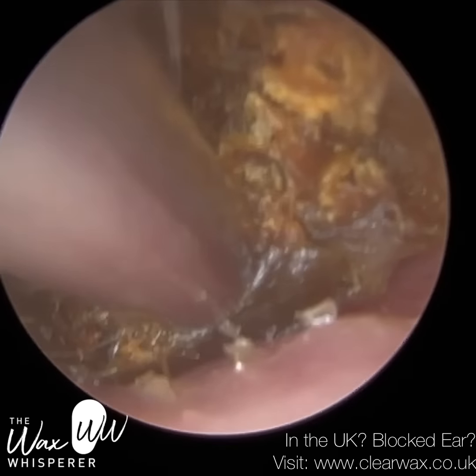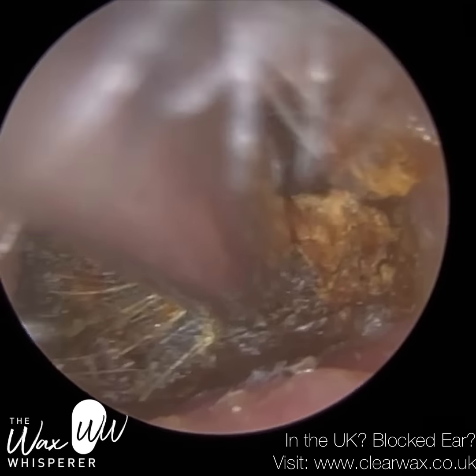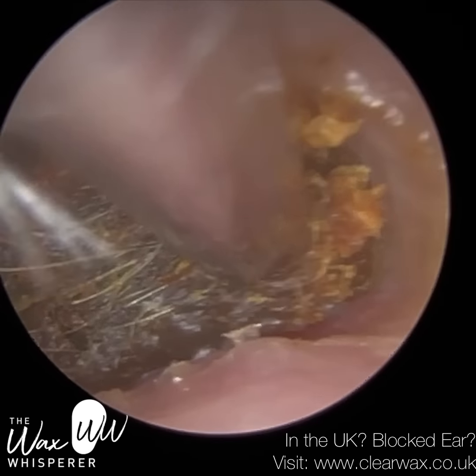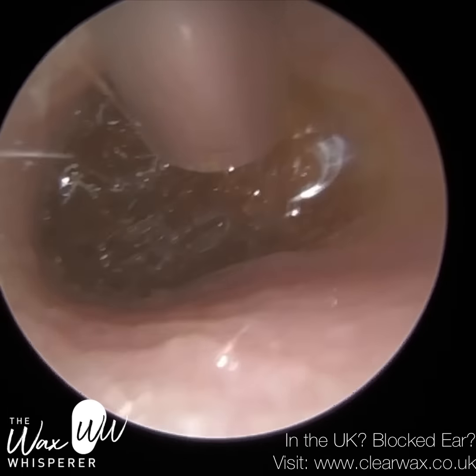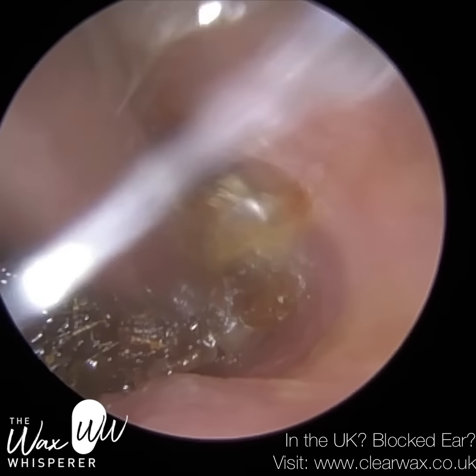almost like, well, not almost, it's almost identical to chewing gum. And this chewing gum has been pushed right up against the eardrum, and it's been squashed up against the eardrum. So the patient has been using a cotton bud, and it's just so difficult to remove. So by this stage, we're fully aware it's keratosis obturans. As I said, it appears to be earwax.